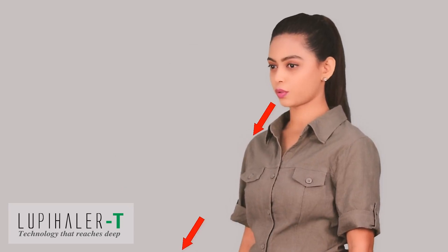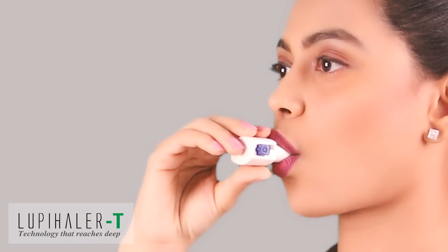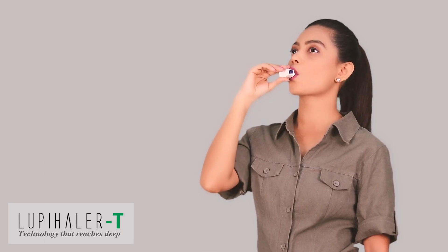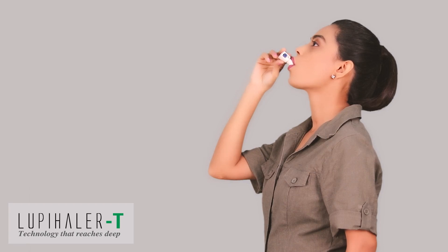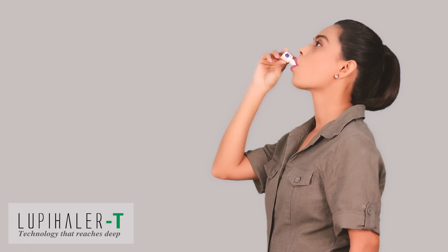Exhale through your mouth. Hold the Lupehaler T and put the mouthpiece in the mouth. Cover it completely with your lips, thus creating a perfect seal, and tilt your head back slightly as shown. Breathe at a steady pace and as deep as you can. The capsule inside the chamber makes a rattle sound — this is a sign that Lupehaler T is delivering medicine to your lungs.